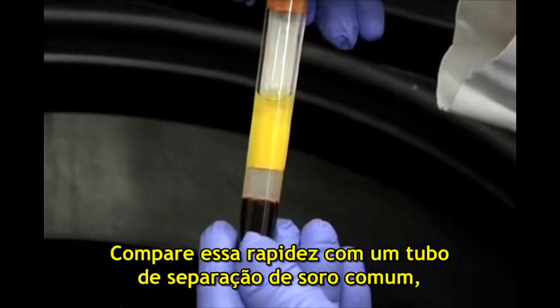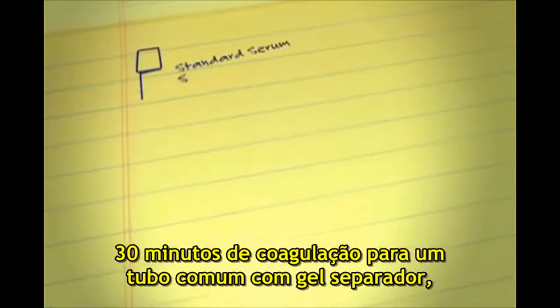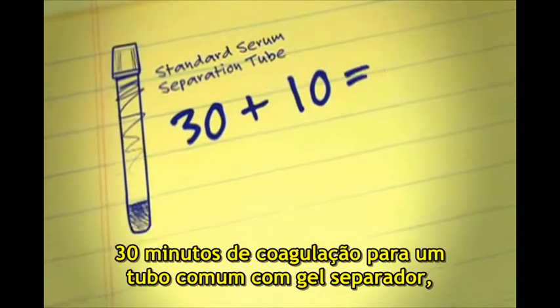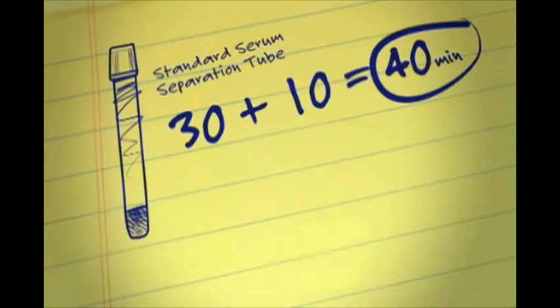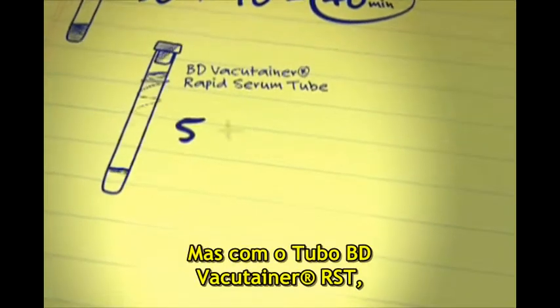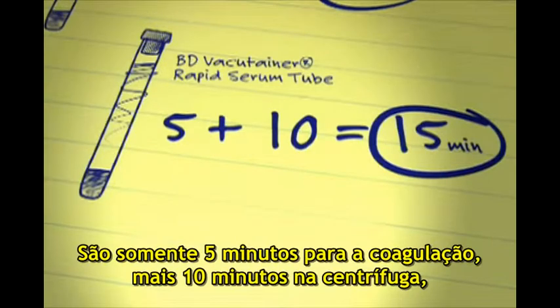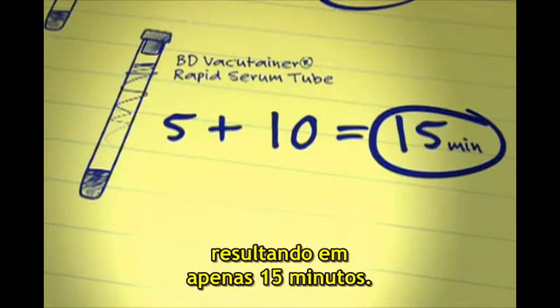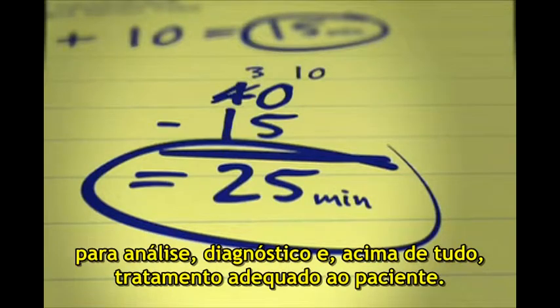Compare that rapid performance to a standard serum separation tube and do the math. Thirty minutes clotting time for a standard gel separation tube plus a ten-minute spin equals a 40-minute wait before the start of analysis. But the BD VacuTainer Rapid Serum Tube's five-minute clotting time plus a ten-minute spin yields results in only 15 minutes — a potential 25-minute head start for analysis, diagnosis, and most importantly, patient care.